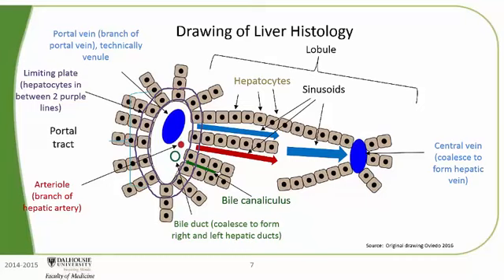The very last thing we are going to label is the Kupffer cell. The Kupffer cell is a type of macrophage which resides in the sinusoids. I think of macrophages as part of a cleanup crew, since their job is to eat debris. The Kupffer cell's job in the liver is to remove damaged red blood cells, bacteria, or debris from the sinusoids.